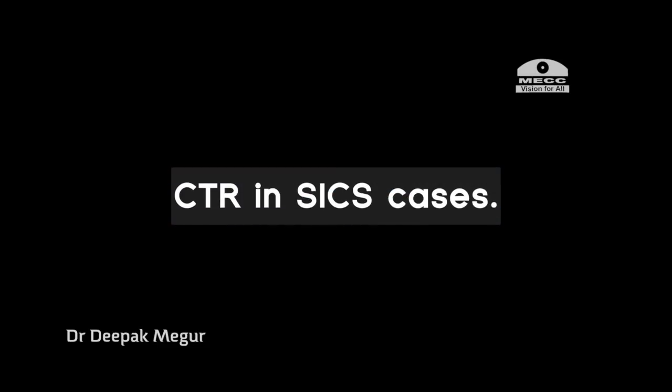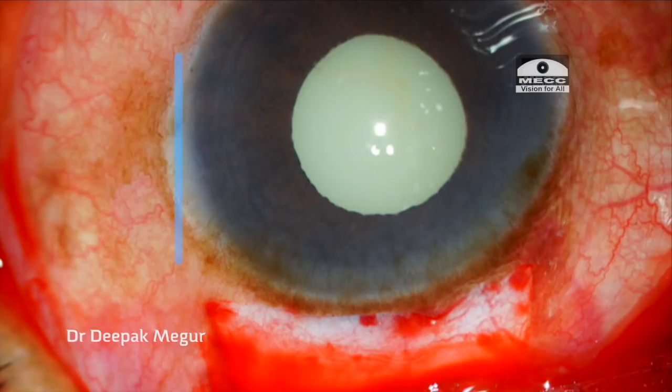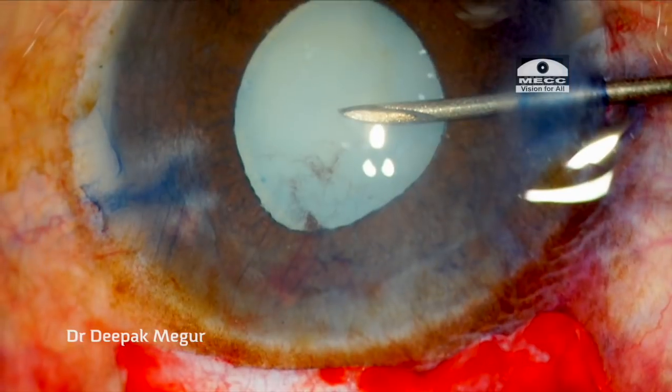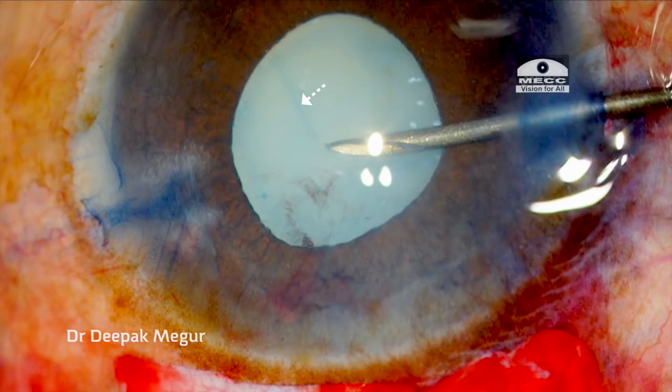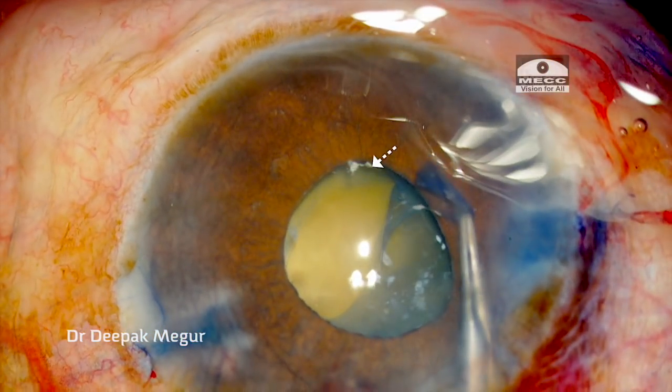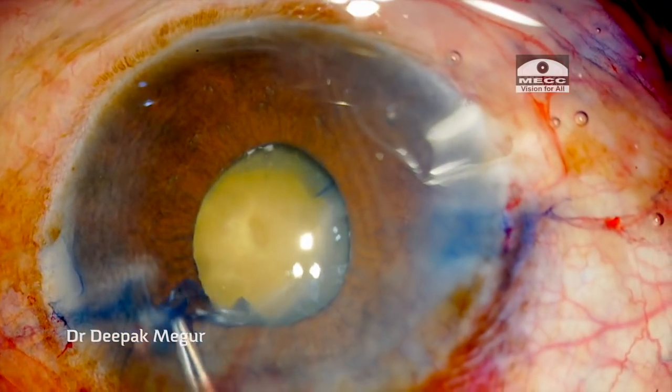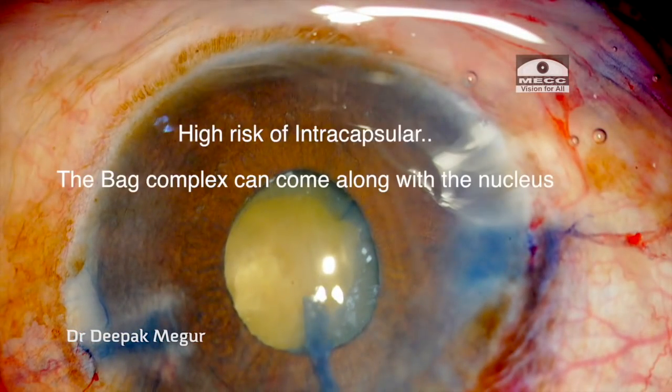Before concluding I would like to share a few cases of using CTR with the manual SICS technique. This is a case of a hypermature cataract in an elderly patient. The issues here are: the pupil is small, the cataract is very mature, and we are dealing with weak zonules. As soon as I puncture the capsule it is evident that the zonules are extremely weak. My plan is to make a larger rhexis, but because the pupil is small and the zonules are so weak, I am concerned that the bag would come off while doing so.